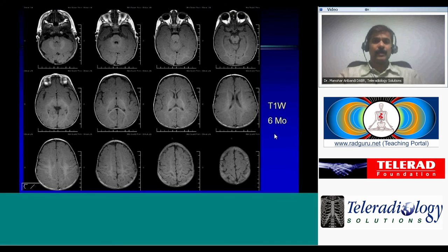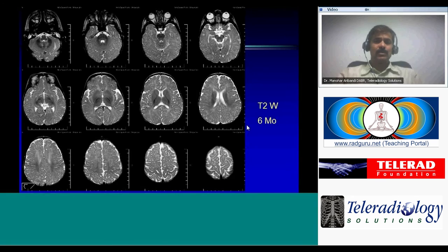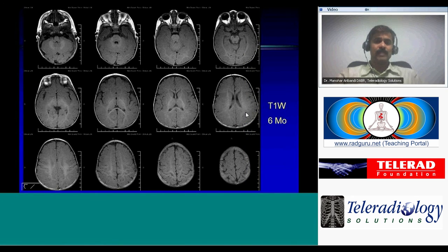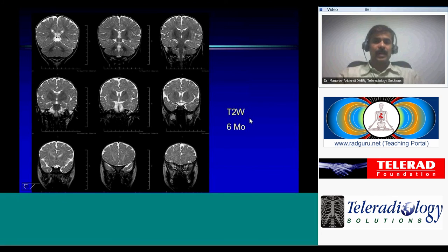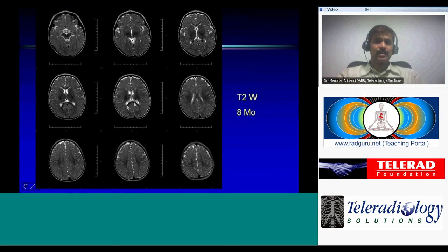At six months, there is a little more myelination in the cerebral hemispheres. The splenium is myelinated and the genu has just begun on T1-weighted images. On T2, the splenium shows hypointensity indicating myelination, and the genu has just begun. At eight months on T2, the splenium shows nice myelination hypointensity, the genu is a little more prominent, and myelination is spreading from around the central sulcus to adjacent parts of the brain.